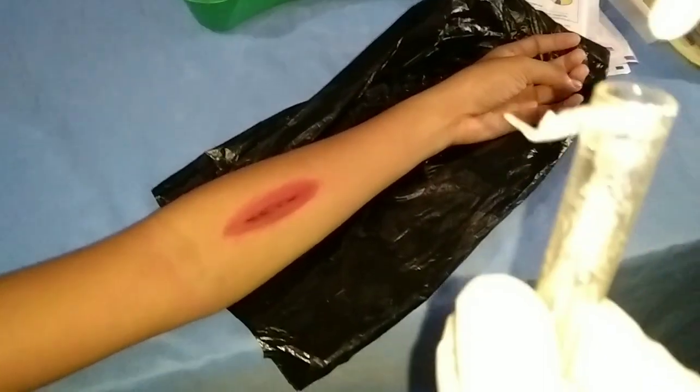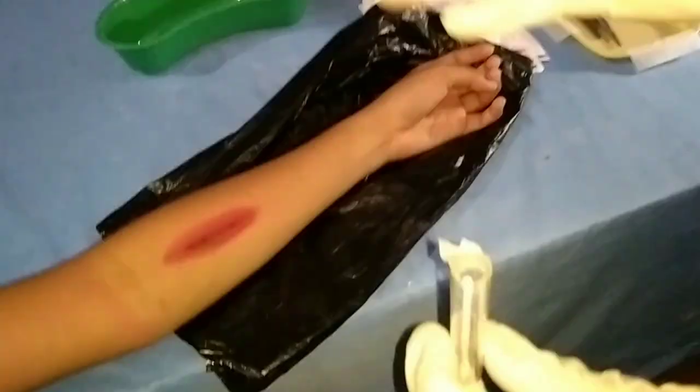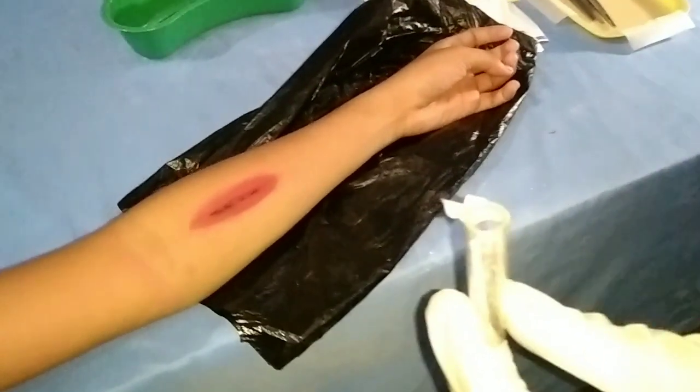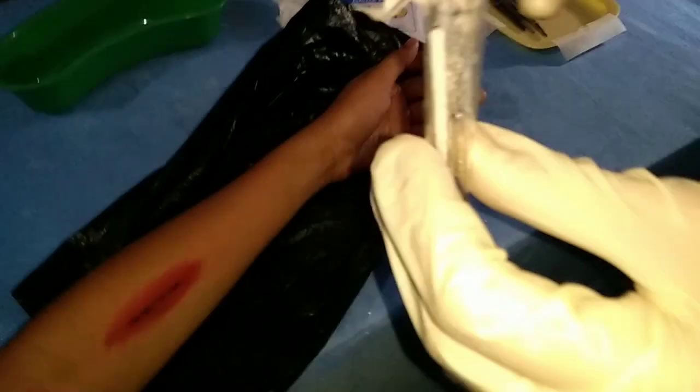So return the swab to the culture tube, taking care not to touch the top or the outside of the tube. Crush the inner ampule containing the medium for organism growth at the bottom of the tube and twist the cap to secure. If a specimen is required from another site, repeat the steps, specify the exact site on the label of each container. Be sure to put each swab in the appropriately labeled tube.